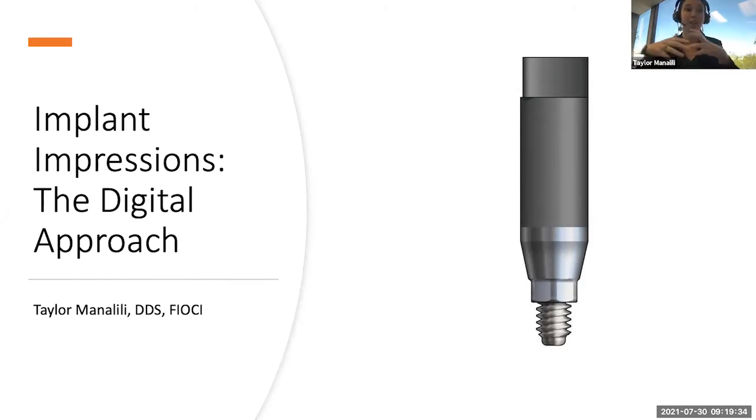And this is because implant prostheses are super rigid, right? So whether we're restoring them with a rigid bar or even a Bruxer prosthesis, whatever we are doing, there's very little give in the prosthesis itself. And as we know, implants are not quite like teeth. They do not have PDL fibers around them. So they are pretty fixated in that bone. You have no wiggle room, like you might have a couple microns of wiggle room with your natural teeth. So it's really important we get very accurate impressions, however we choose to take our impressions.